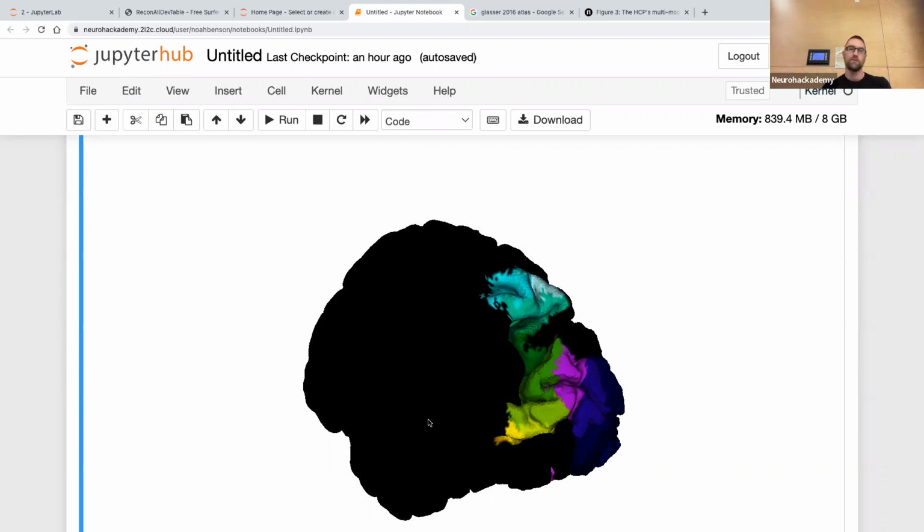I do this for visual field maps, which vary in a very smooth way across cortex, so linear interpolation is the right way to interpolate them. And so we deal with this at every step. Whether you figure everything out in volume space and interpolate to the surface, or figure everything out in surface space and interpolate to the volume, it makes almost no difference in what you finally get. Only in cases where you've got something weird going on, like looking at things in a very narrow sulcus where there's a lot of partial voluming effect, will there be much of a difference, I think. Yeah, but that's a great question.